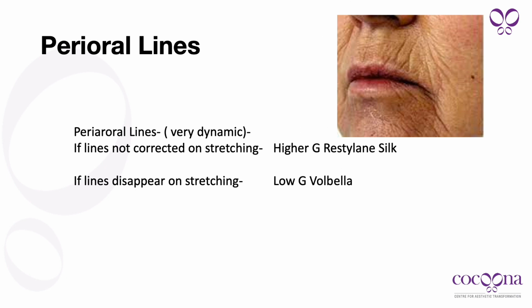But if you see the lines disappear on stretching, then you could use low G' fillers, which is Volbella, very carefully placing along the lip contour and just subcutaneously in the areas of these vertical lines.